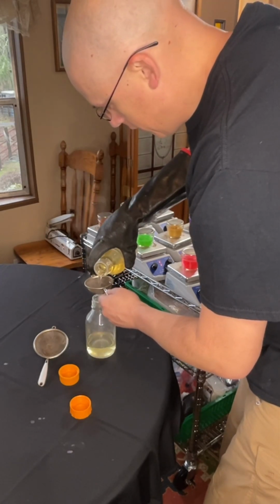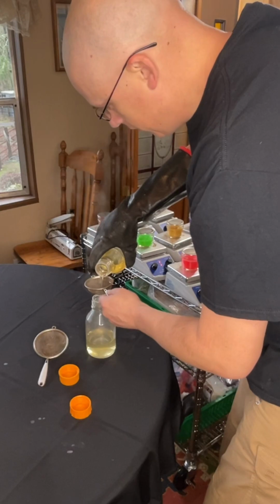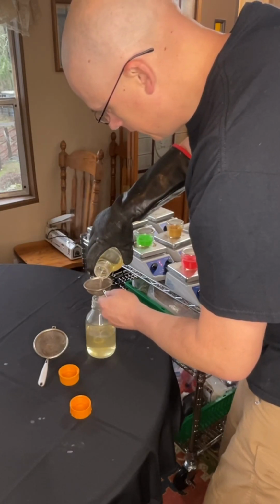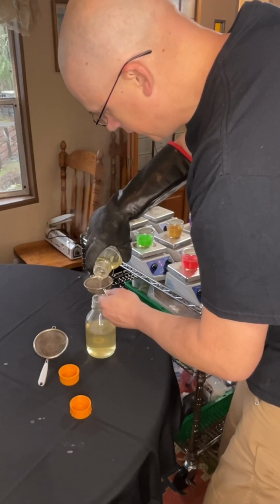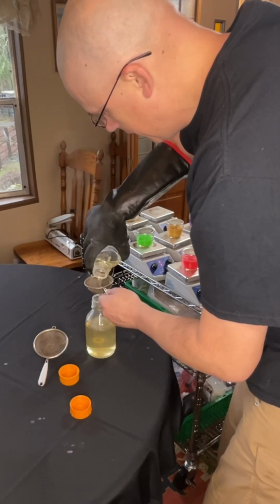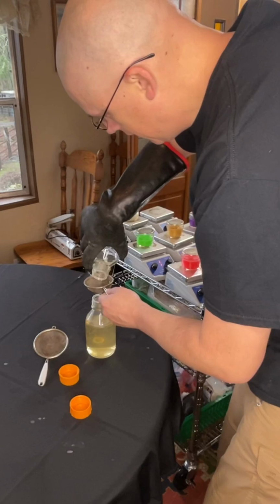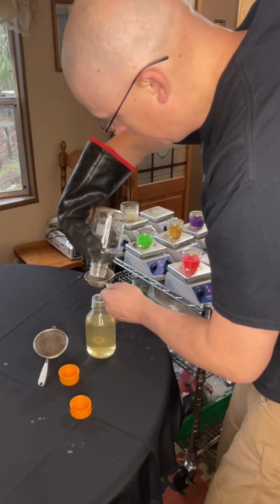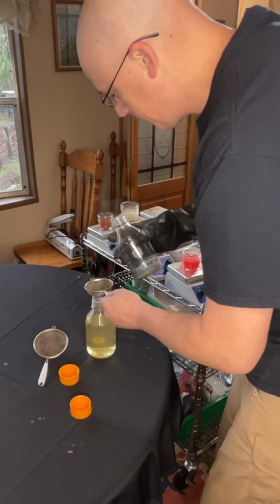The reason I put it into a fresh bottle is because often there's parts of the non-mixed in gelling agent on the sides that will stick to it that you can't see. And then when you go cook them and try to pour it, you end up with all those chunkies.